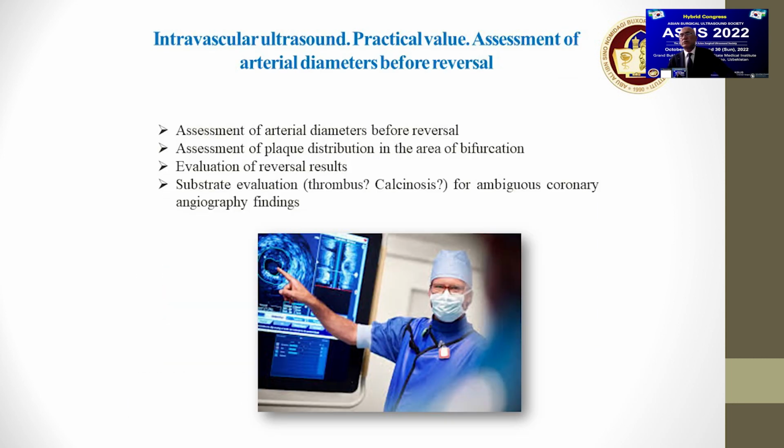Practical value. Assessment of arterial diameter before revascularization. Assessment of plaque distribution in the area of bifurcation. Evaluation of revascularization results. Substrate evaluation, thrombus, calcinosis. For ambiguous coronary angiography findings.